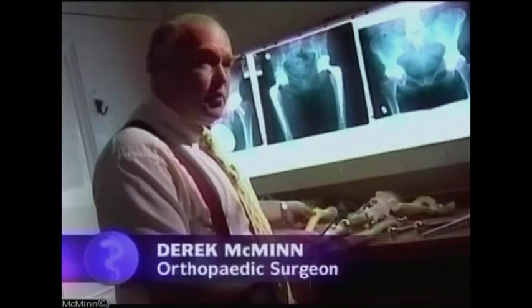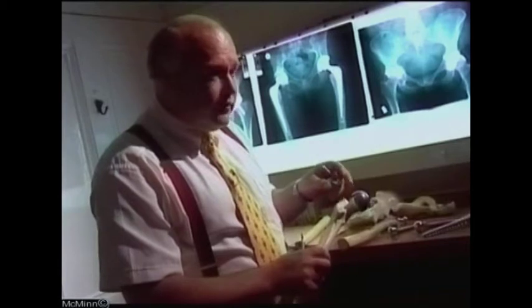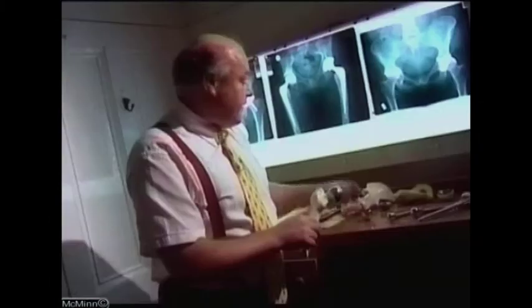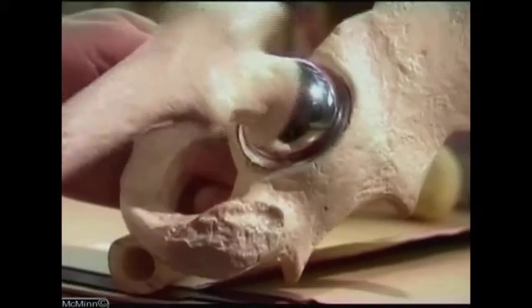The Birmingham Hip Resurfacing involves preparing the femoral head, not cutting it off, and putting a new surface over the femoral head to replace the worn-out articular cartilage. And that articulates against a new metal shell, which is also put on the socket. That gets rid of pain and allows restoration of function.